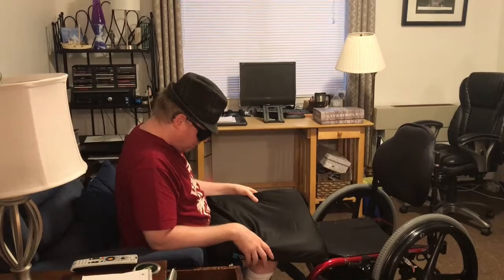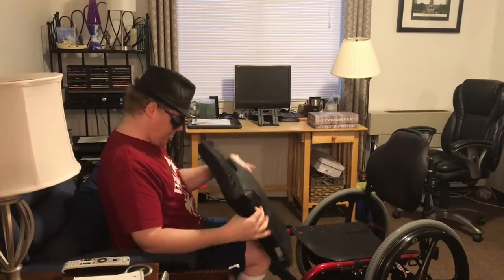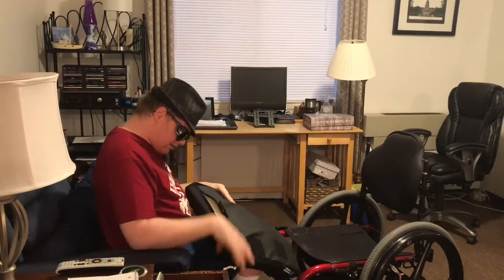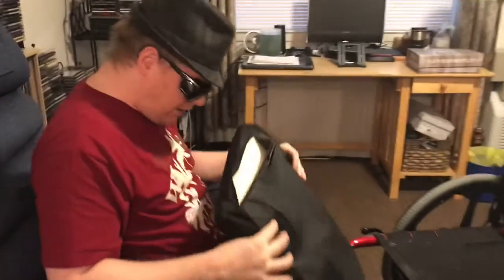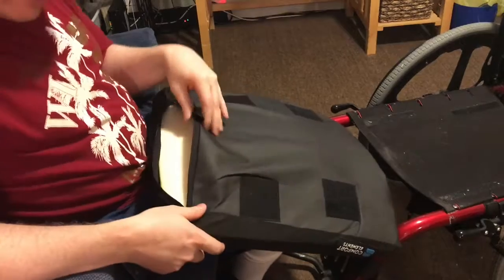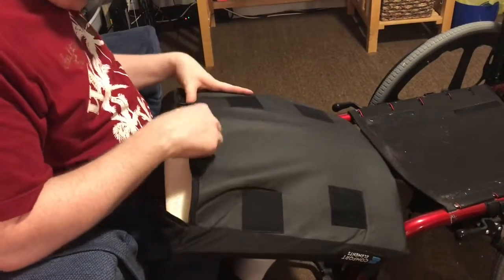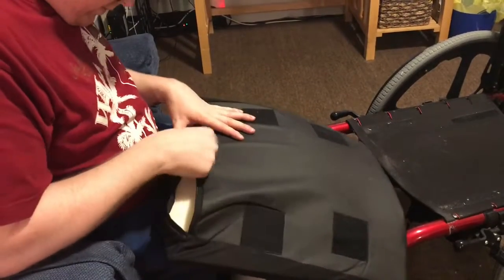So what you're gonna want to do is — some cushions have a little zipper on the back right here, if you can see that. If you have a zipper back here, what you would do is pull the cushion out, and then you'll just be left with the cover.